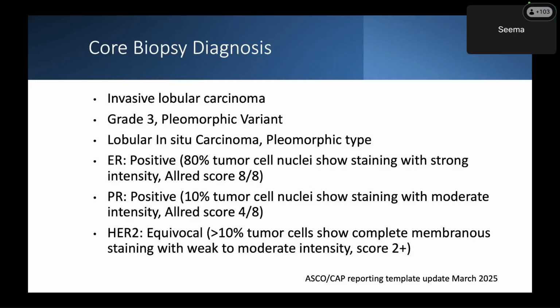Yeah, very valid point. So this is the first prototypical case of invasive breast carcinoma that we have included, and I would definitely like to underline what Dr. Seema said, that the initial part that I showed, that you have to have adequate fixation, neutral buffered formalin, good quality formalin. Please do get that in the lab, because all kind of testing and management is dependent on your fixation.